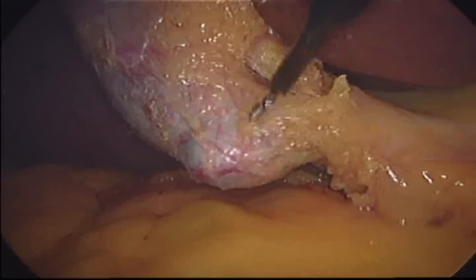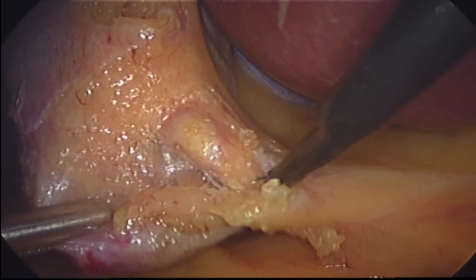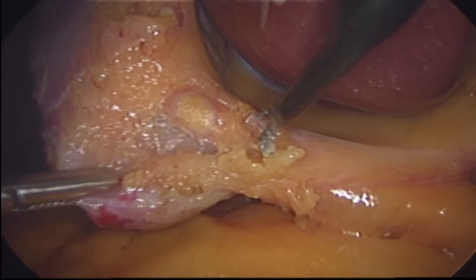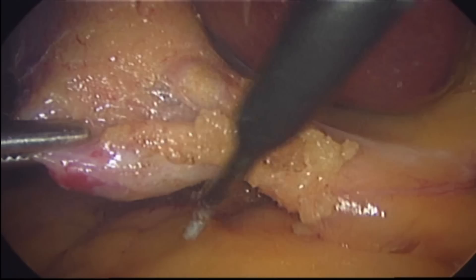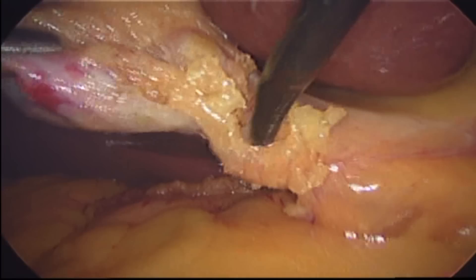The first part of the operation is to dissect out the cystic duct, which joins the gallbladder onto the common bile duct, and the cystic artery, which provides its blood supply. Both structures are surrounded by fat and this is being dissected free of these important structures using diathermy.